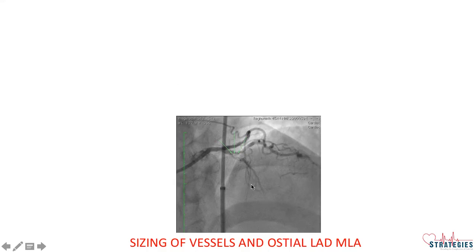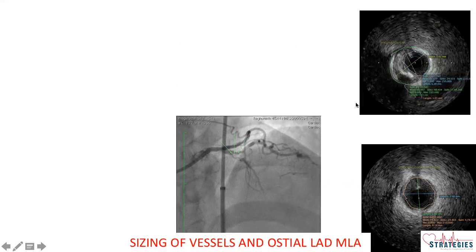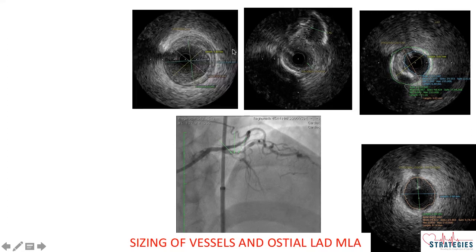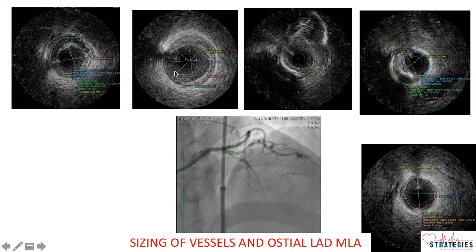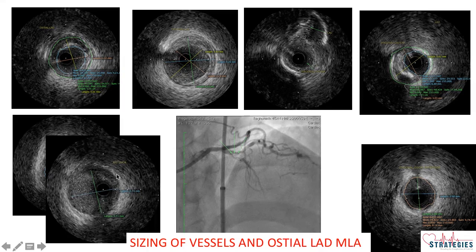Coming to the sizing of the vessels to plan the stenting strategy, in this case the diagonal looked almost 2.9 to 3 mm, and this is ostial diagonal which is around 3 mm. This is the entry point for LAD, and proximal LAD is looking around 4 mm. This is ostial LAD with MLA of more than 5 mm square with a plaque area of around 50 percent. I decided to leave ostial from stenting. This is a polygon of confluence with 9.7 mm square and this is LMCA with mild plaque.